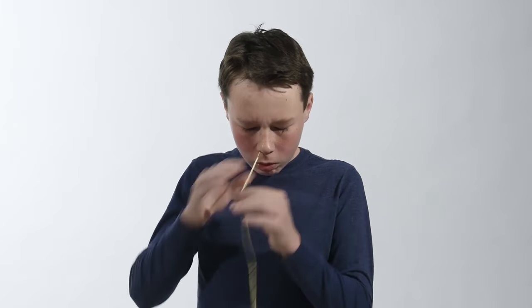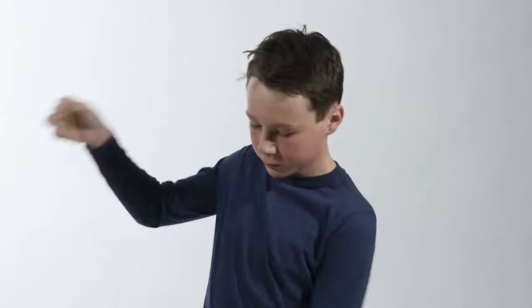If the pH paper shows a number greater than five, it might mean the tube is in the lungs. If this happens, remove the tube and replace it with a new one. If your child shows any of the following symptoms since placing the tube, take the tube out immediately and call their doctor.